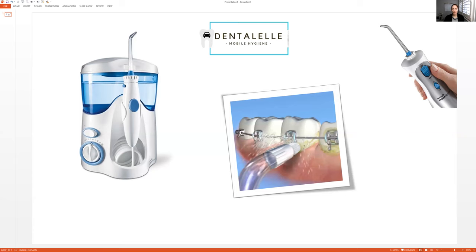Waterpiks come in different shapes and sizes. The main thing to look for is that you can fill it yourself with water and that it has adjustable speeds. If you want something portable, choose a smaller unit. The nice thing about a larger unit is that you don't have to fill it up as often. It really depends on your needs and what you want the Waterpik for. It's also nice when it comes with different attachments, but the main one you need is a thin tip to get right in between the teeth.